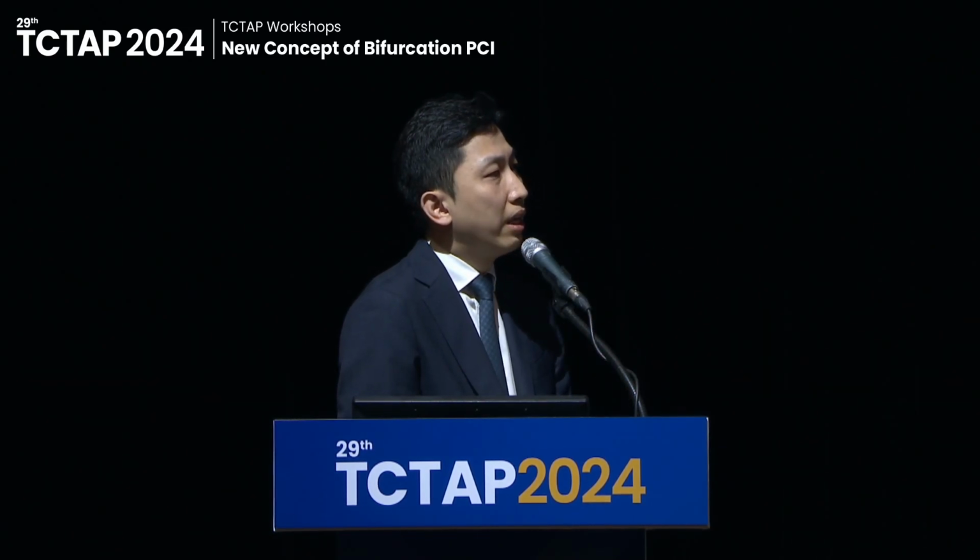Actually, what I hope is 0.001 millimeter, but it's not feasible. It's a little bit dangerous, because we can lose the lesion. So trying to make a mini or nano is not important. The important thing is not to lose the diseased side branch, I believe.